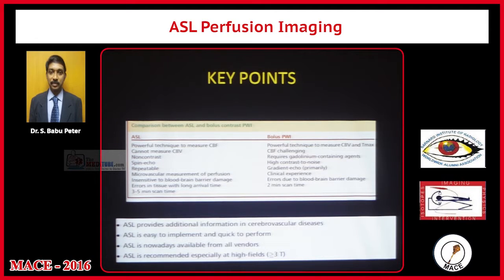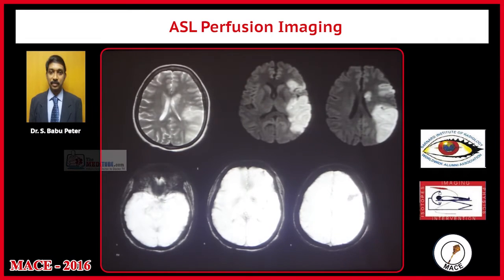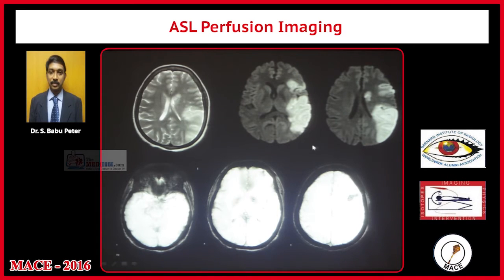The main advantage of ASL is it is now available with all vendors and is generally recommended at higher field strengths — 1.5 or 3 Tesla. This is a typical case of an acute infarct on a T2-weighted image; you see the hyperintense gyral thickening and edema with restricted diffusion, and this is the SWI image that shows a few areas of gradient blooming.